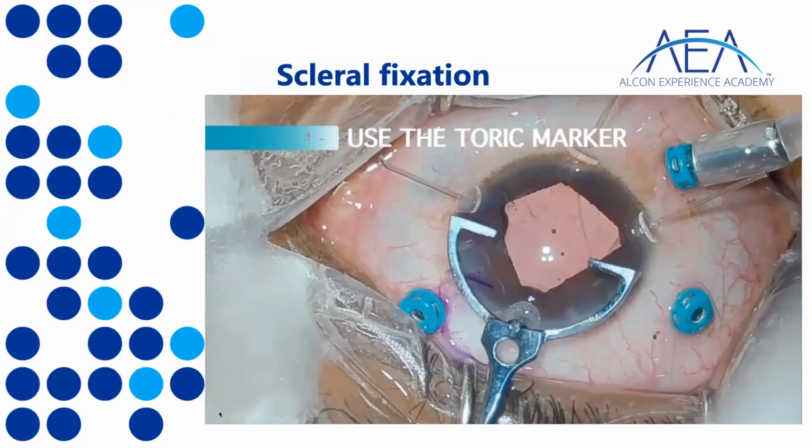I will show you. There are very many different techniques to perform a scleral fixation. One of the questions I'm always asked is clearly which one is the best technique. There is no best technique. The best technique is the one which works in your hands. So if you are happy with the standard one, by all means go ahead with that one. If you want to use any of the modified ones because they work better, please be my guest.